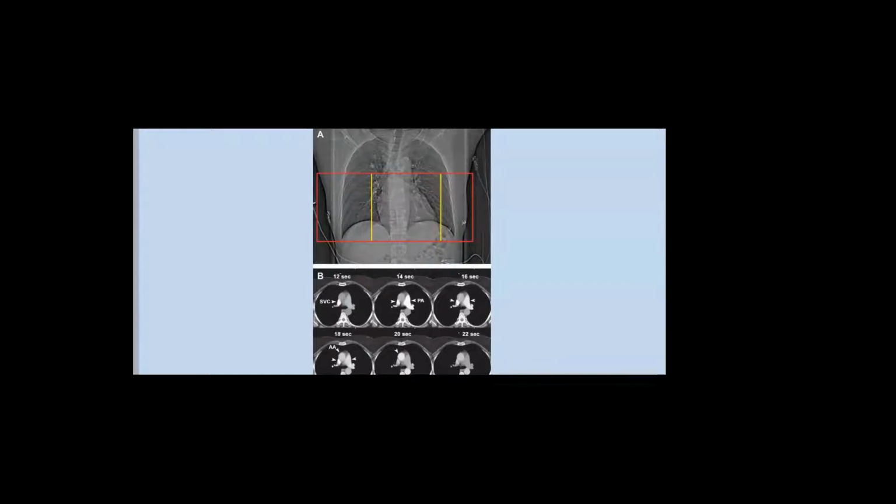But this topogram or scout image is not used for all. So if the purpose of the study is a CABG graft, you are going to elevate your topogram or scout to the clavicle because the graft comes from the LIMA and stuff like that. So you have to be up. So the scout image will be from the clavicle to the diaphragm. Okay.